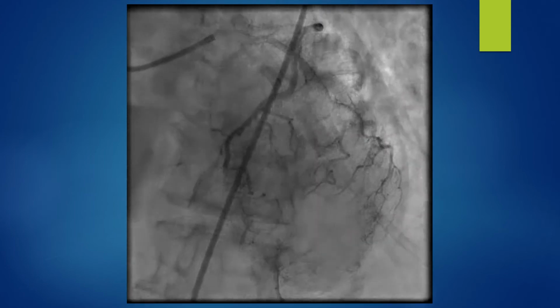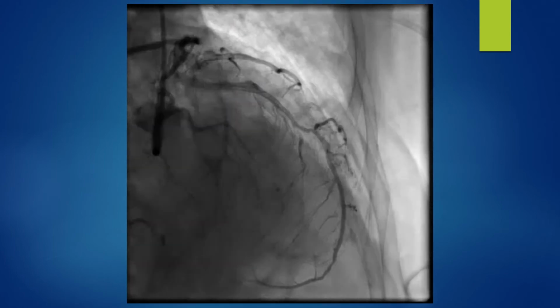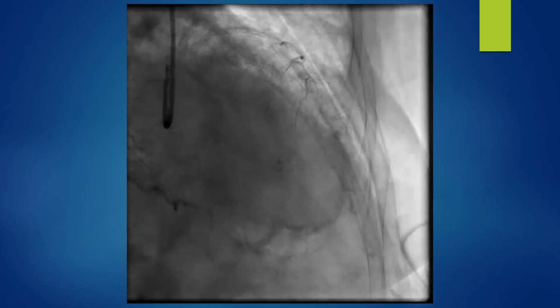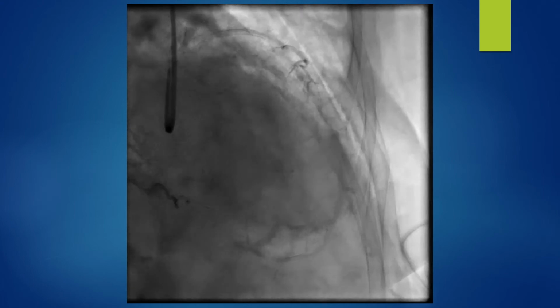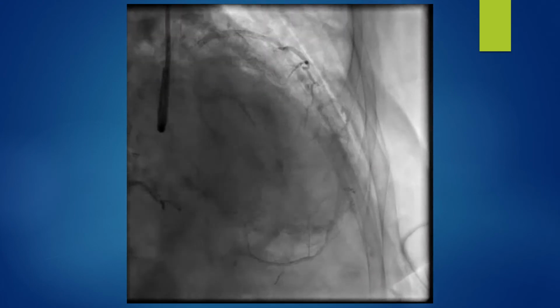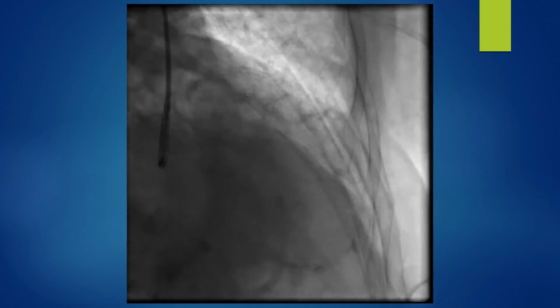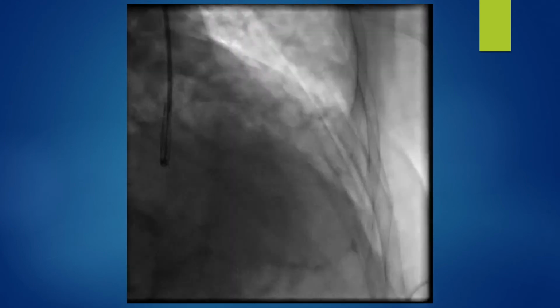I post-dilated the proximal segment of the stent, and this is the final angiogram, and you can see it's a well inflated and well apposed stent in the ramus. We decided to leave the distal OM lesion for medical management. I already had 2-stent PCI in an 88-year-old lady who is at risk of developing contrast-induced nephropathy, for multivessel PCI in the same setting. And it's a small, very tortuous vessel.